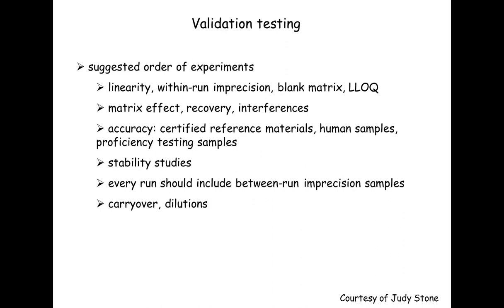So, for example, we usually use our quality control material for the imprecision studies, and so you would basically run your quality control material with every run anyway. You would also have your calibrators, so you can look at linearity.